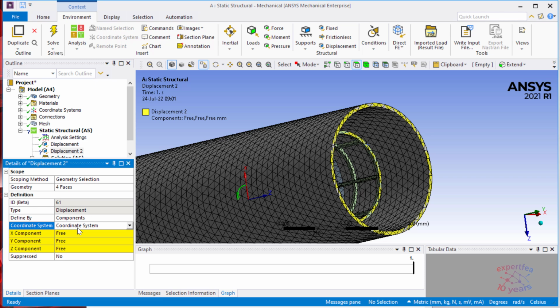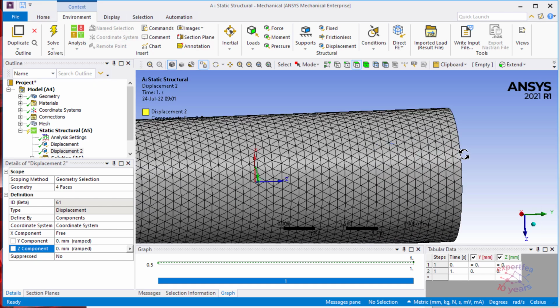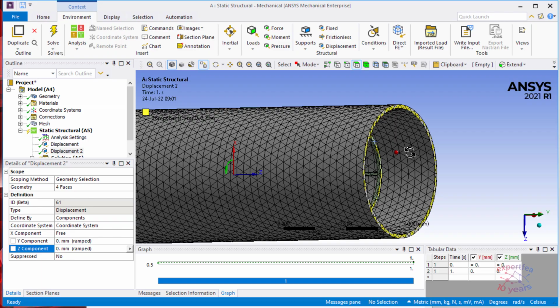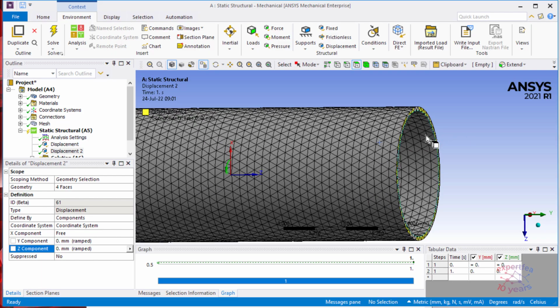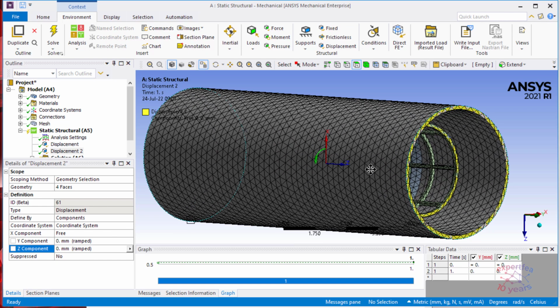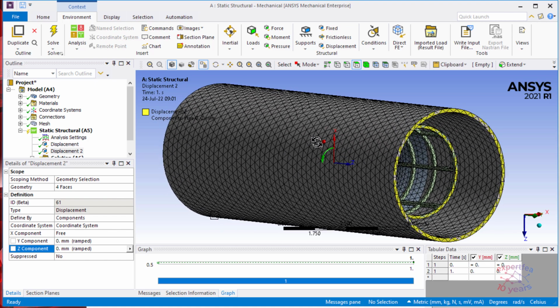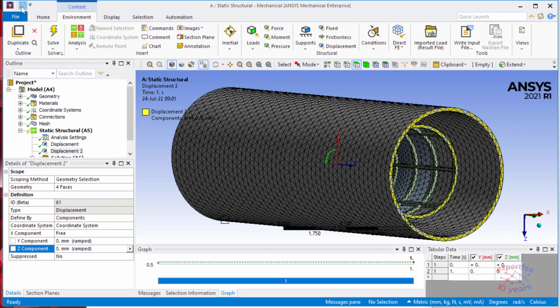Let's select here the coordinate system. We will leave the radial component free, then the y and z we will make 0. Somehow we will not allow shortening, and we will not allow rotation of these two bodies. We will not allow the rotation about the y-axis. When we apply more and more boundary conditions, we remove the unknowns in the finite element equations, and this means that we help the solver solve the FEA much faster. So these are the boundary conditions.